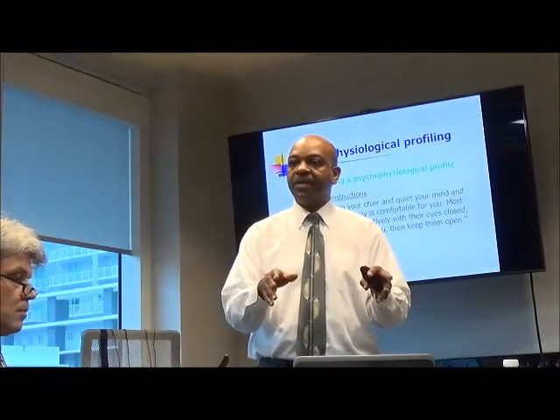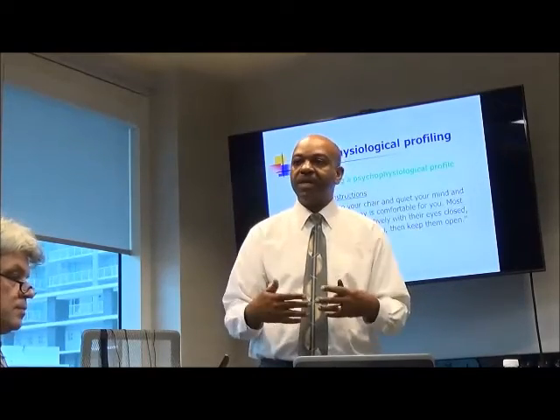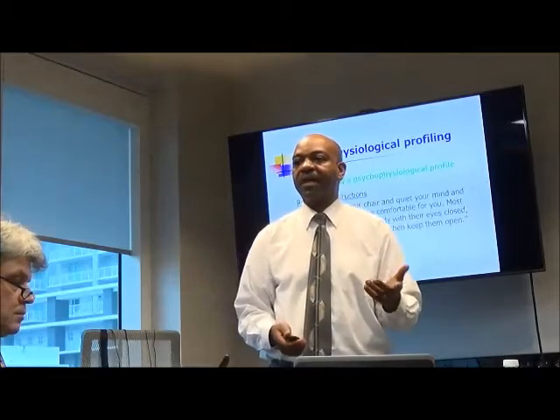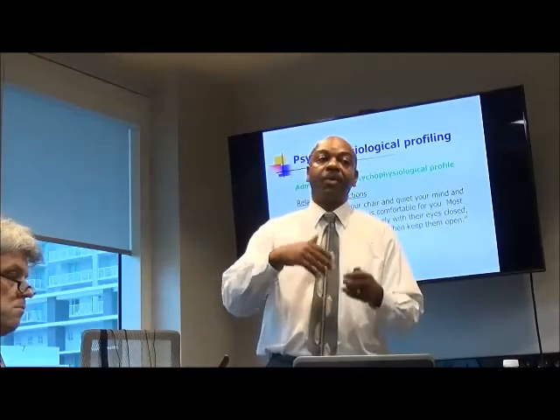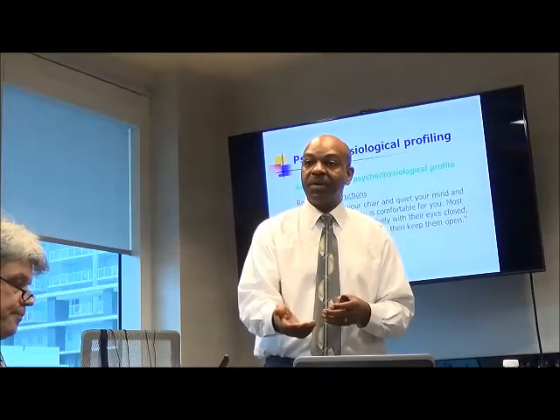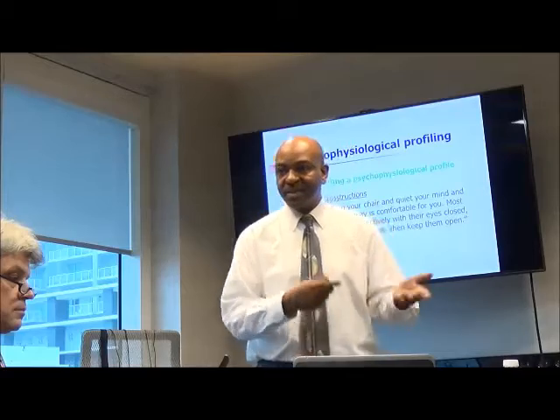You don't feel anything from this test. There's no electricity going into you. It's only measuring things like your heart rate and muscle tension. And then I also tell them that I'm going to show them the results afterwards and explain it to them, so that I don't get a lot of questions during the task, because that can throw the readings off.